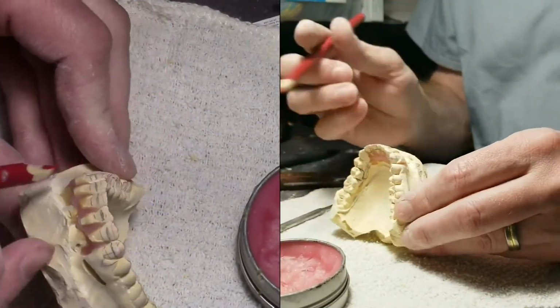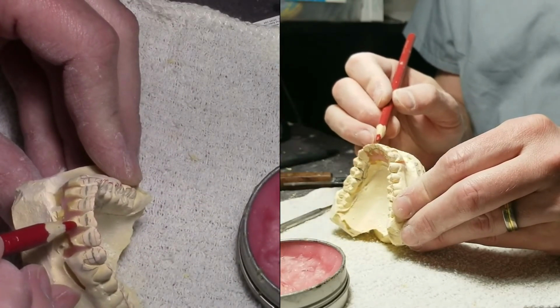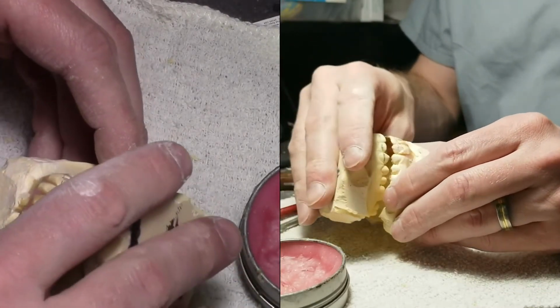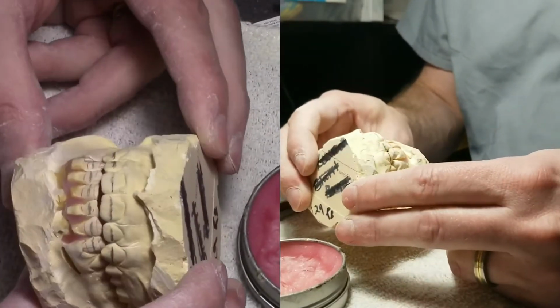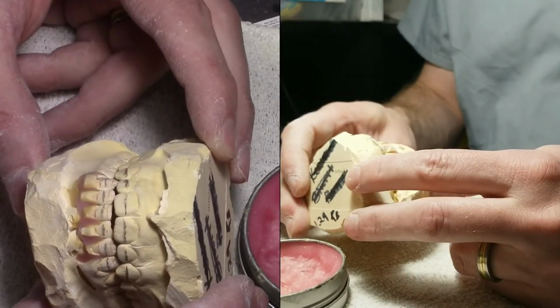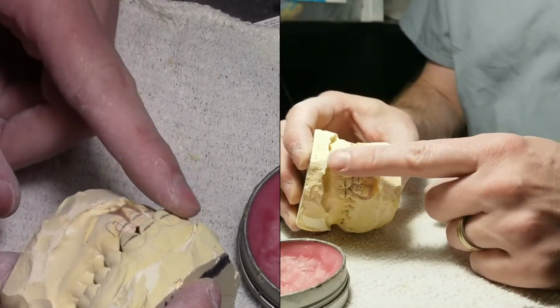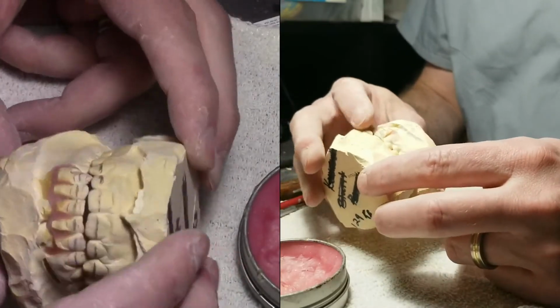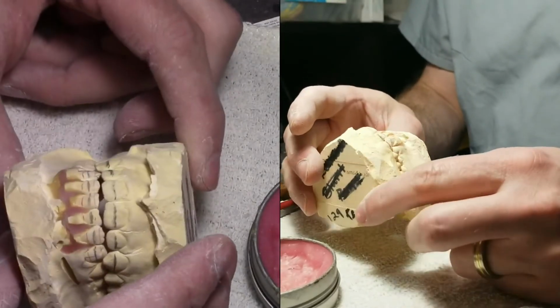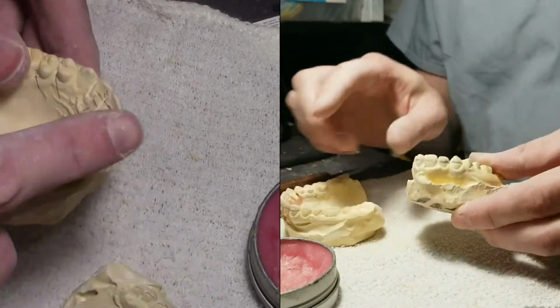Again, the lines that I drew helped me keep them all level. It's kind of difficult because this one was a little shorter than the rest of them because it was so much further back. But you can kind of see we're about halfway done, and a long way to go. I don't know how much spring aligner can pull these teeth down, but we're going to try and pull them down, close that bite opening. Maybe the doctor has some tricks up his sleeve that will help with that. So back to the other camera, and we'll cut out these upper teeth.